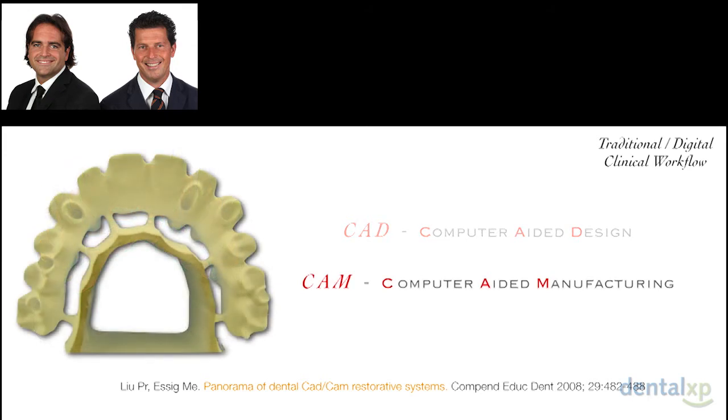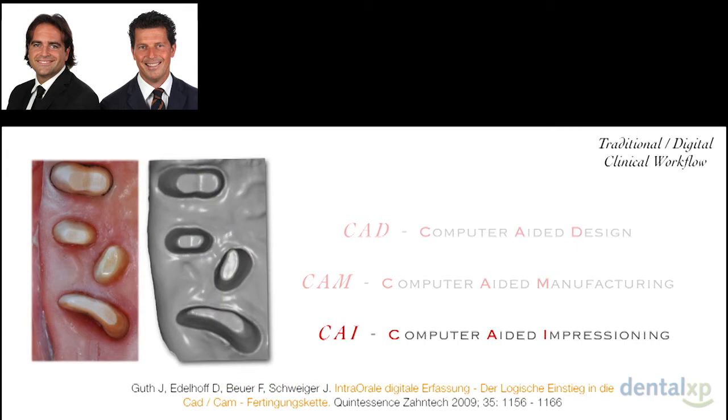While computer-aided manufacturing permits, thanks to an industrial process, producing the designed object with a homogeneous raw material. These two definitions are already clear to all of you, but recently a new concept has been introduced, computer-aided impressioning, which permits recording three-dimensionally the oral cavity situation thanks to the advent of intraoral scanner machines.